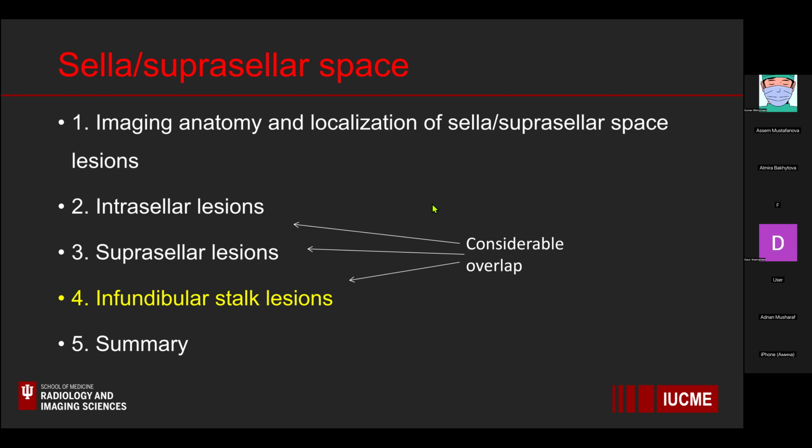Does DWI help in differential diagnosis between meningioma and pituitary microadenoma? Okay, between meningioma and microadenoma.